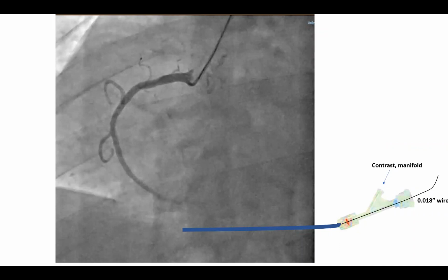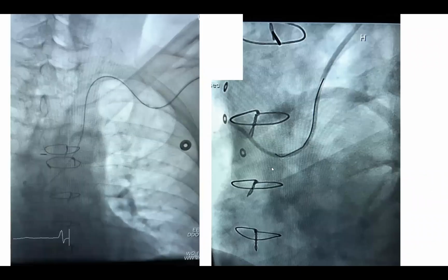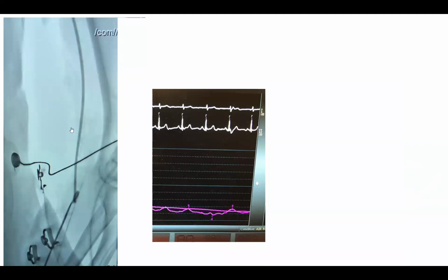And what's your hint to that? As you're torquing, you're obsessed with this. And how do you know you're starting to kink that catheter? Well, one, when you're seeing that you're torquing a lot and it's not transmitted, stop. Get the wire and do this maneuver. Don't wait for the kink to happen. So know this technique. Now, if it does happen, excellent answer, you lose the pressure tracing. So you really don't want this to happen. If you keep torquing in place and the torque doesn't get transmitted, your pressure gets lost.